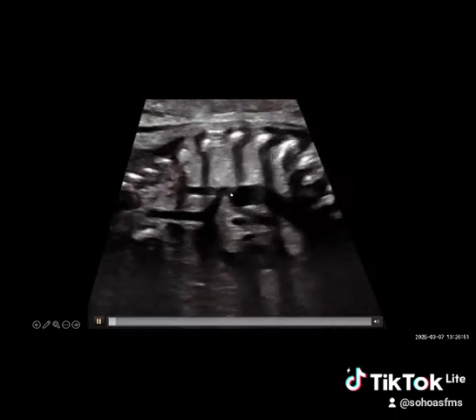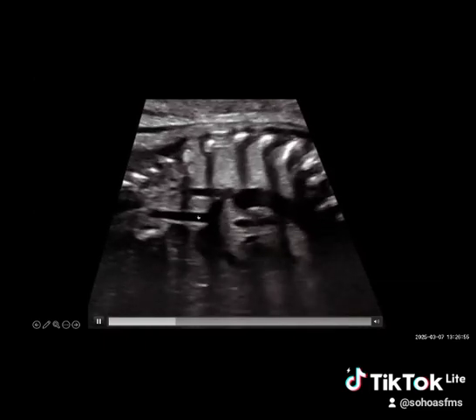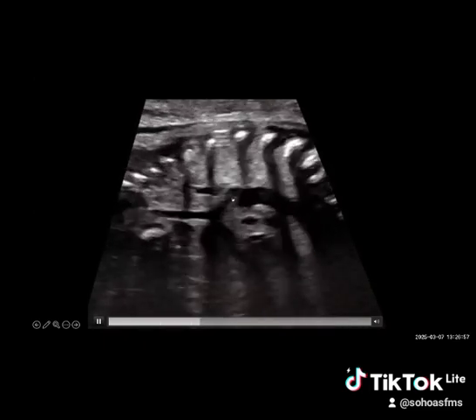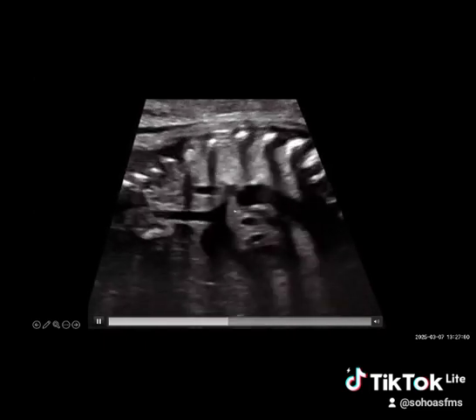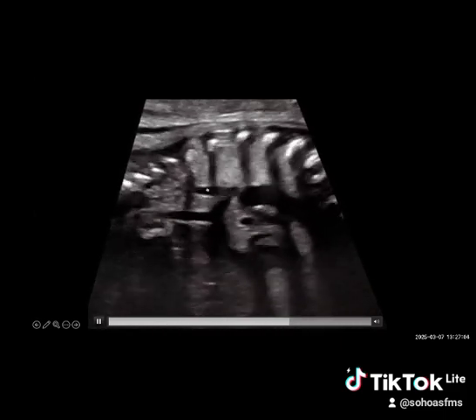When a patient presents like that, it is very easy. We can see a very diffuse arch hypoplasia. The arch is the same size as the common carotid and left subclavian arteries. There is a posterior shelf, very obvious disproportion, and an increased distance between these two vessels.